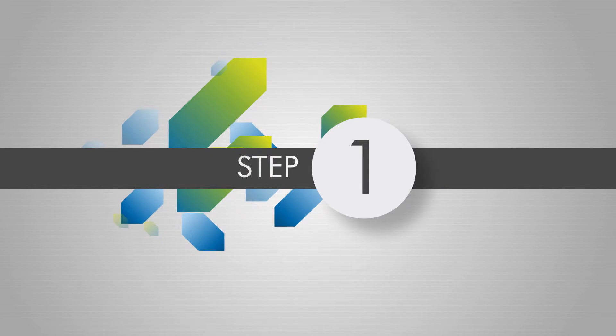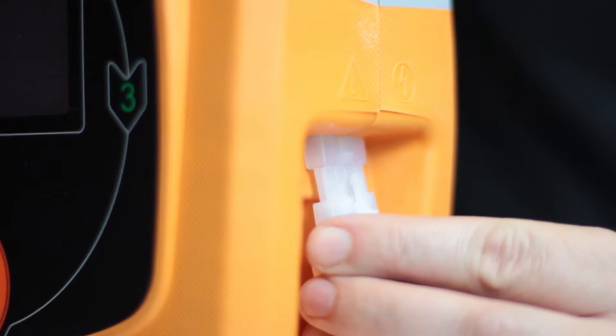Call for emergency assistance before beginning to use the device. If someone is with you, ask them to make the call while you proceed to immediately treat the patient. If the pads are not yet connected to the eSys, connect them by plugging the connector into the port on the side of the device.